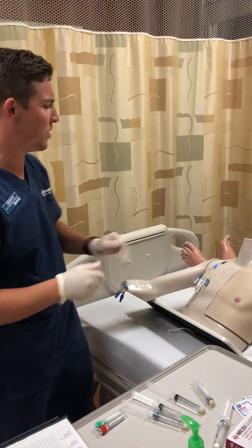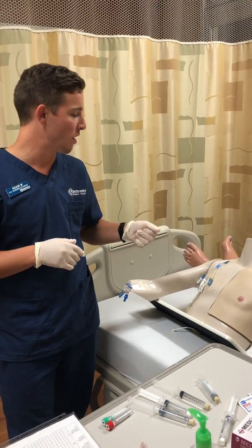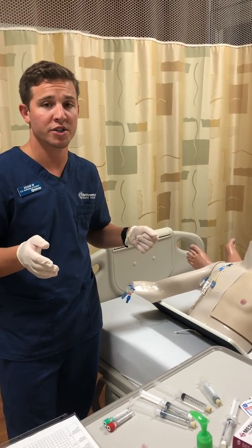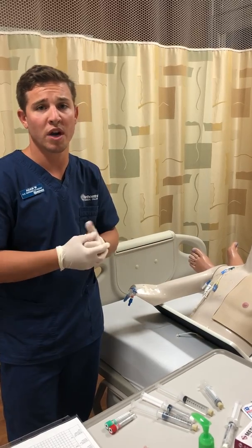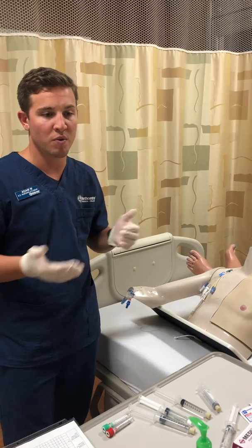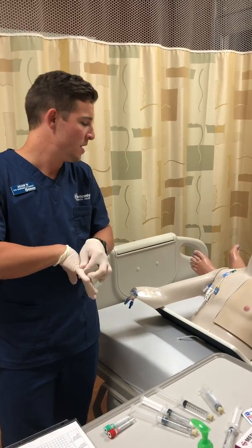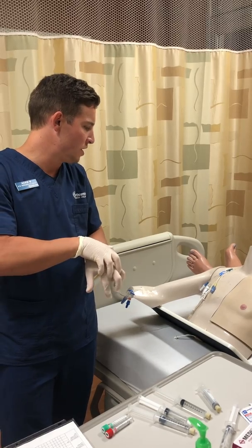If they had some IV solutions hooked up, you'd want to pause it for 2 minutes so that we can draw. If it's life-sustaining medication, fluids, you would obviously want to keep that running. If there is TPN on there, you do not want to use a line that's with TPN unless it's your only access. So that is another consideration with that.